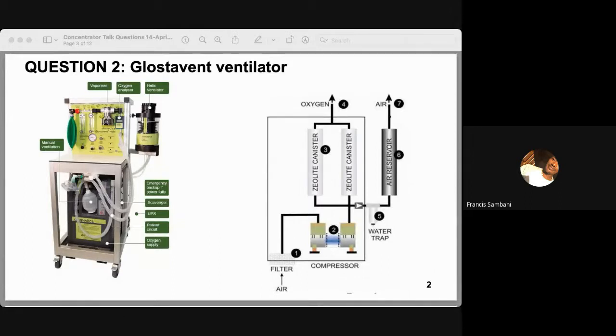So the anesthesia machine has flow meters for medical air and oxygen. When one fully opens both flow meters for air and oxygen on the anesthesia machine, they will not be able to achieve the maximum purity they could achieve if the flow meter for air were fully closed.